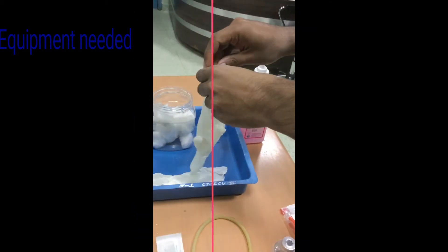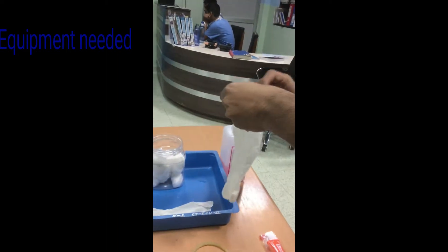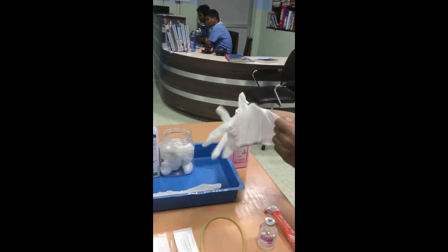Now let's start the IV cannulation. First, perform hand hygiene and apply clean gloves.